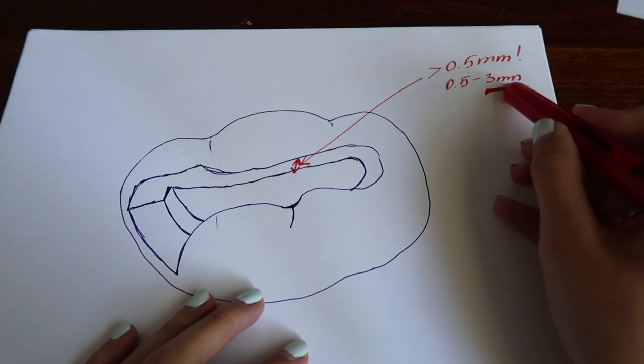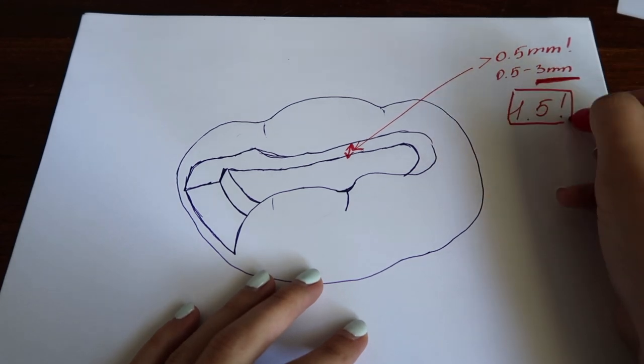The other end of the range depth-wise is three millimeters — you can make it as deep as three millimeters, which is huge when you actually look at the prep. So you have a lot of wiggle room. One and a half millimeters is ideal perfection — that's what you're aiming for, and that's exactly the depth of your 330 burr. You can just place it without activating it everywhere in your prep and see if the active part of the burr matches the depth — if so, you did a good job.